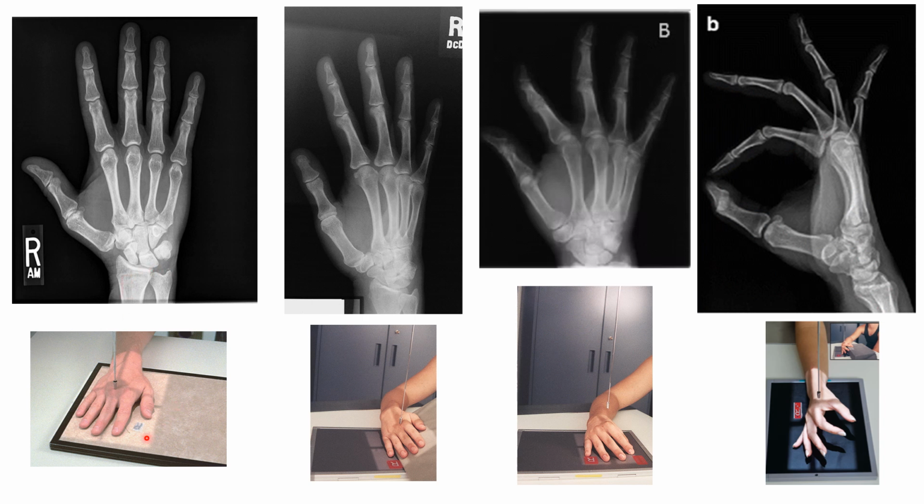And then when you're collimating, be sure that you've included all of the soft tissue of the first digit, the thumb there. That one sometimes gets away from us. Sometimes you might have to just move the patient's thumb back in. Sometimes they'll have their thumb sticking out too far and you can just move it back in without overlapping the soft tissue between the first and second digit. So be aware of that so that you don't clip the distal phalanx of the first digit there.